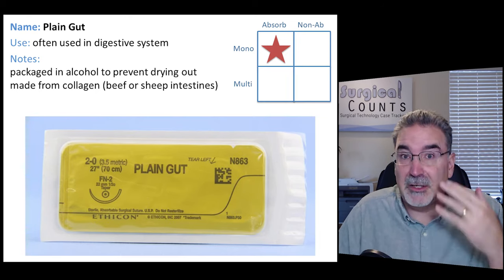Now, different from that is you can have still a round needle, but it's a softer, blunter point. It's not a real sharp point. It's got a blunt point. So this is going to be a blunt point needle. And the reason you would have this is if you're going into very soft or very delicate tissue, you want it to pull through nice and gently. You don't want to cut through that and cause it to tear. So a blunt point needle you'll use through very soft, very friable tissue. There's another word you're going to hear, friable tissue. It means it's very soft. It pulls apart very easily. And in those cases, you're going to use a blunt point needle. Now, the opposite of that, if you have some really tough tissue, let's say some fascia, which is kind of like gristle, it's real tough, or even skin in many cases can be tough, you're going to use something called a cutting needle.